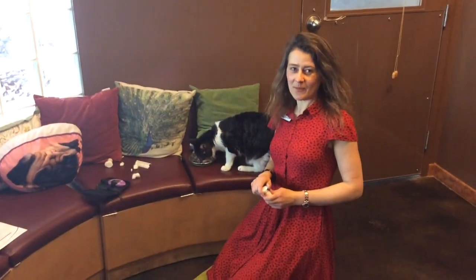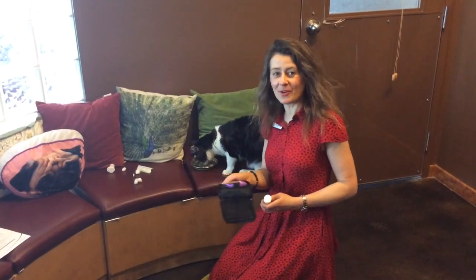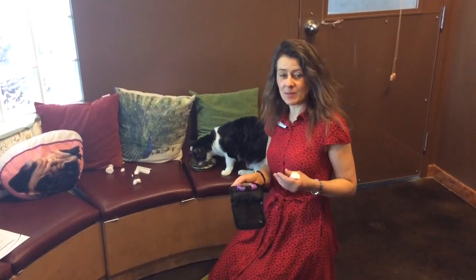Hello, I'm Dr. Julie Schell from Bow Bottom Veterinary Hospital and today I would like to show you how to use an AlphaTRAK glucometer to take a cat or a dog's blood sugar readings.